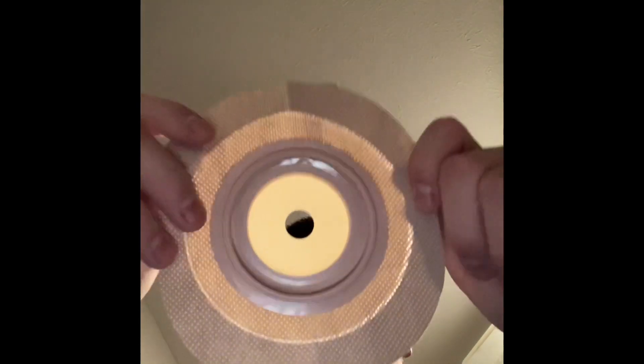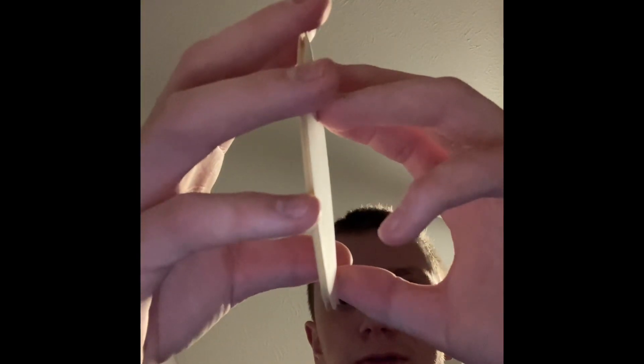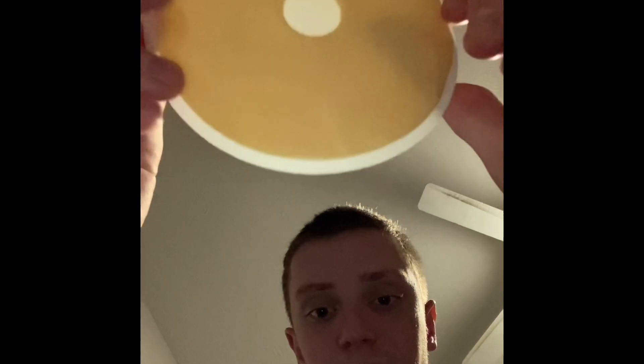This is the ostomy wafer. This is the packaging for the Convitec disc. That's the Convitec disc. These are the protective white backings for it. I would take off both sides, but then my oils and my fingers would get on them.